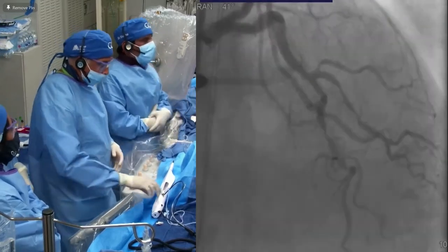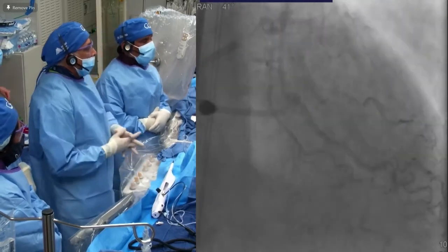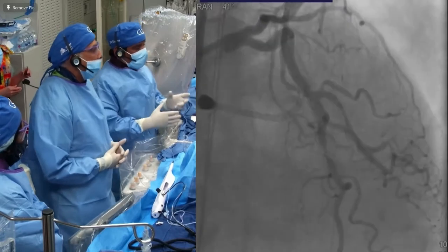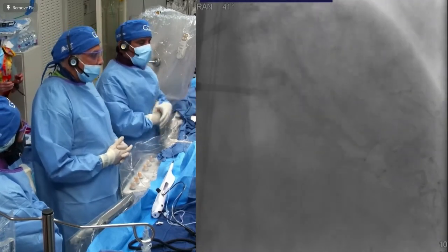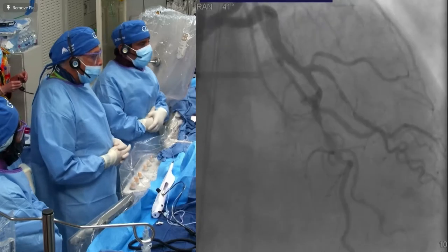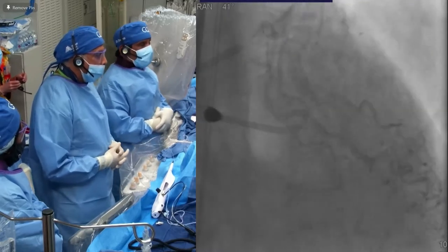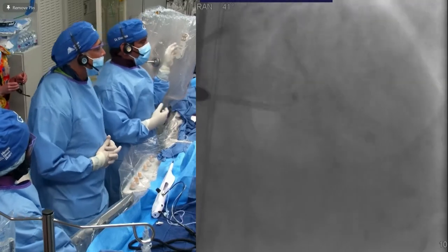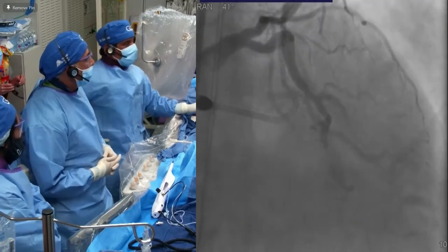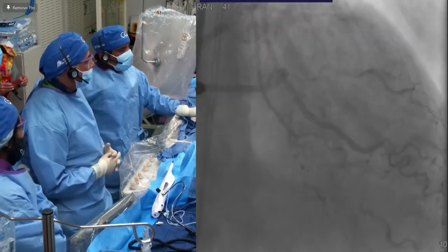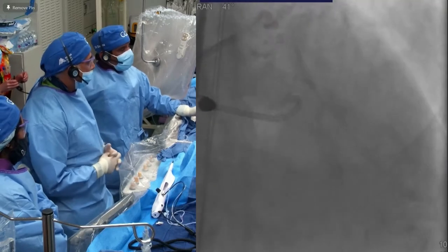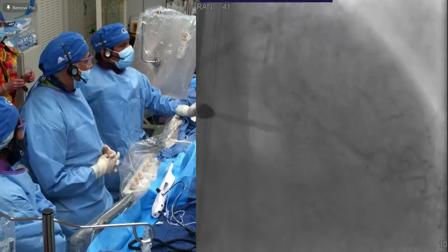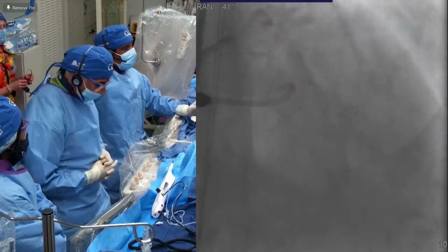We are ready here with that calcium. It's a large vessel, and that is where our algorithm - we are trying to put it down. We always have a good algorithm of orbital or rotational atherectomy. We'll show those cases today to our audience. But the question is, where does the IVL come in? IVL, which is recently approved. This is the kind of case - maybe because of tortuosity, maybe just use a small burr followed by IVL for a synergistic effect. We call it rototripsy.